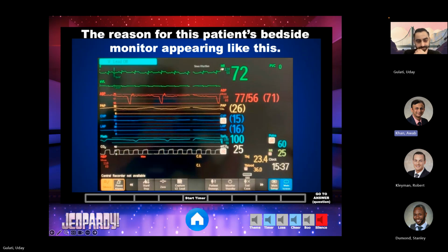So why do you still have electrical activity, but not an actual beat? Is this kinked? Are you saying is the PA catheter kinked? How would you explain the arterial line?